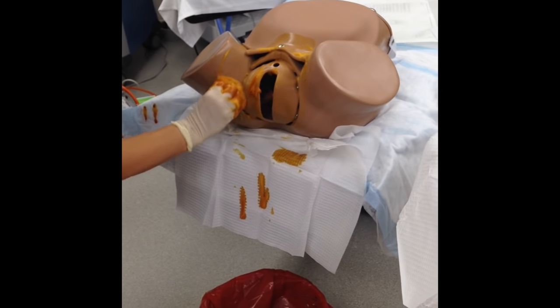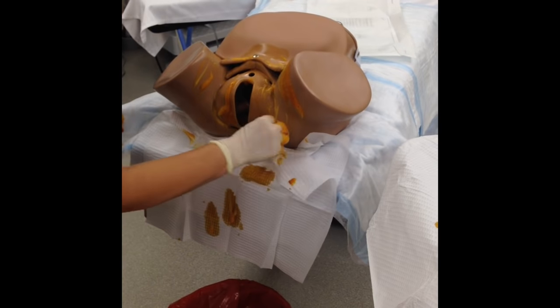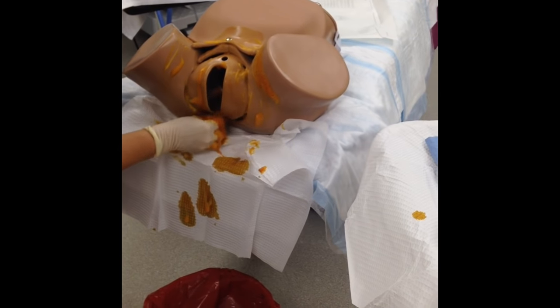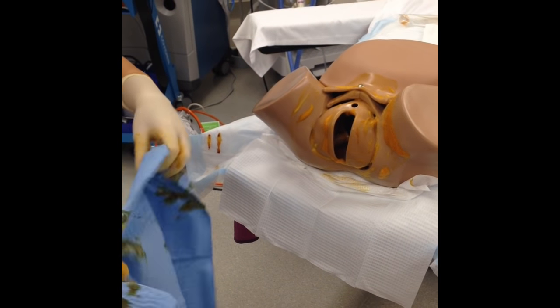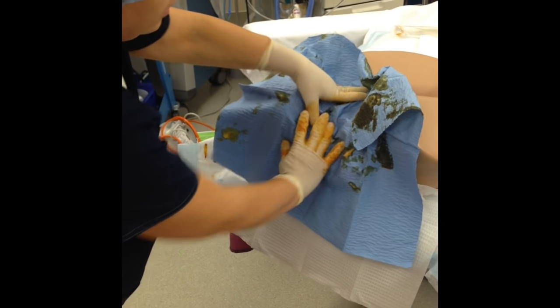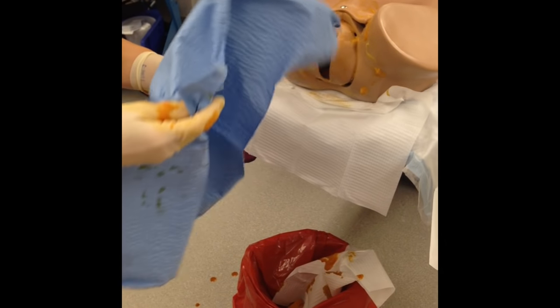Then we're going to start back about mid-thigh or so — we're going to go up to the mid-thigh side with the prep. Then we're going to go ahead and blot her in between the scrub and the paint portion. Take your blue blotting paper and lay it carefully, maintaining aseptic sterile technique, and then peel it back so as not to contaminate anything. I'm going to do this twice to get some of the excess bubbles off.